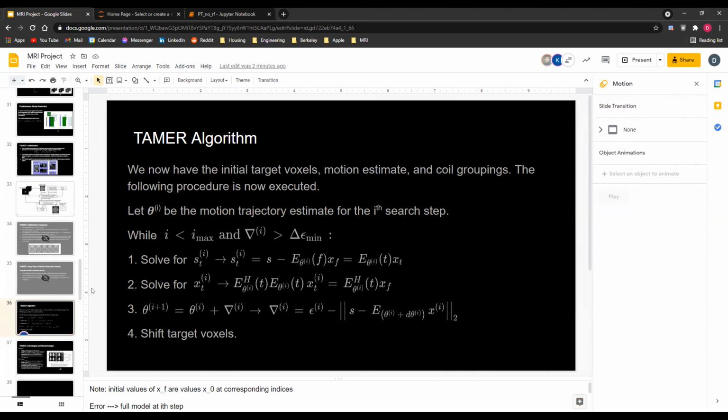What's the motion that it tries to correct for? Is it global motion? Is it local? Generally, for this paper, rigid motion, head rotation, right? Yeah, that's considered rotation and translation. Okay. So does it answer the question about the eye movement? Would that be global rotation and translation, or more local rotation and translation? I think it would be more local, but I don't necessarily know that this wouldn't work for that though. So that's where we'd have to look into it. I don't think they have looked into it.